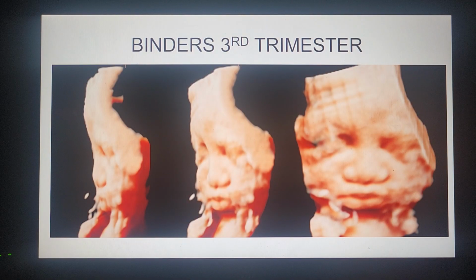Sometimes patients accept the facial dysmorphism and rule out associated abnormalities and continue. So this is a binder's fetus which went into the 3rd trimester, where the 3D still confirms the abnormal phenotype and rules out other significant facial anomalies.